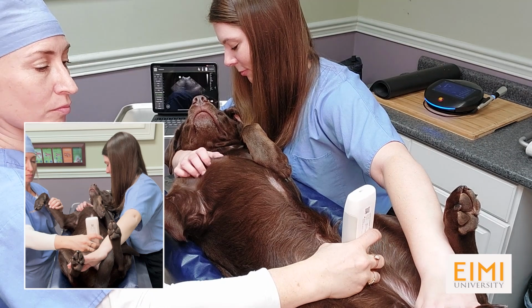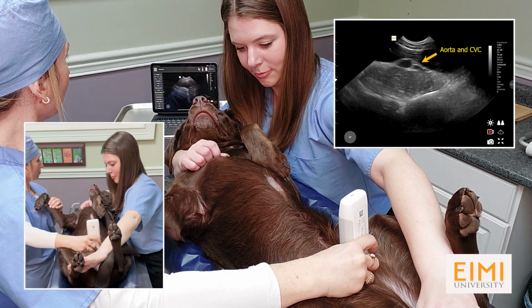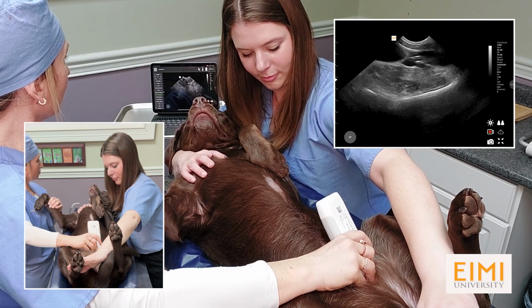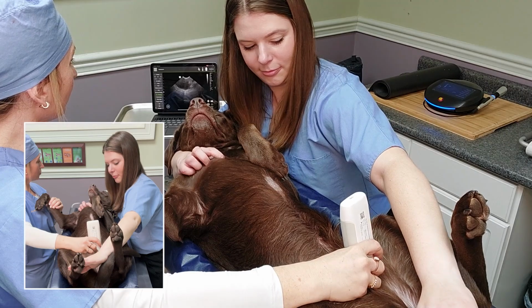Rotate the probe 90 degrees with the marker to the patient's right to examine the bladder in a transverse orientation. Rock or slide the probe left and right once again while moving along the midline to examine the entire length of the organ.